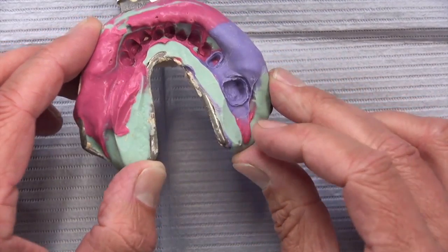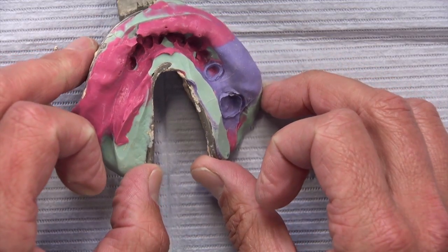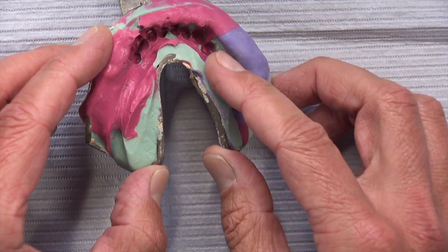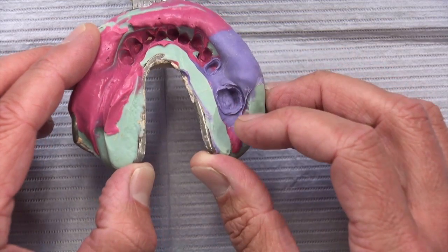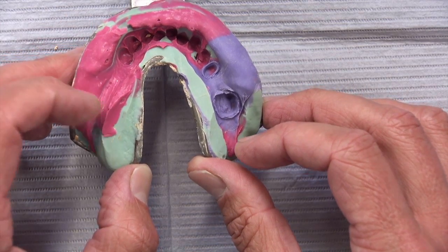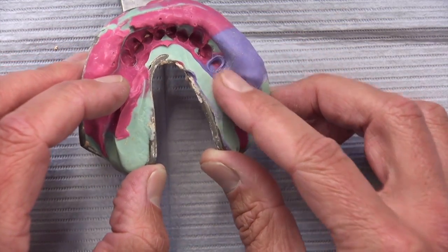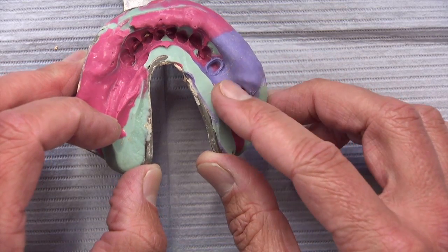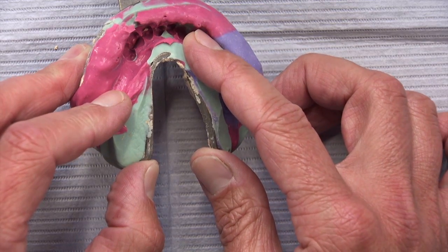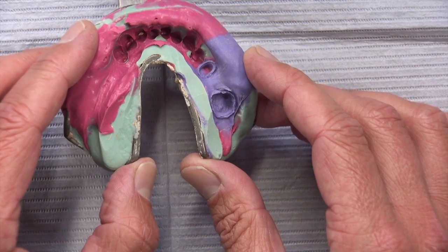When you syringe material around the tooth and your assistant puts material in the tray, then you seat the tray material onto the syringe material and they set simultaneously — they will not peel apart like this. But when you see the purple material only on the prep teeth and the rest of the teeth are just covered in red, there's got to be a difference in vertical height between those two prep teeth and the rest in the red. That's one of the issues with the H&H technique.